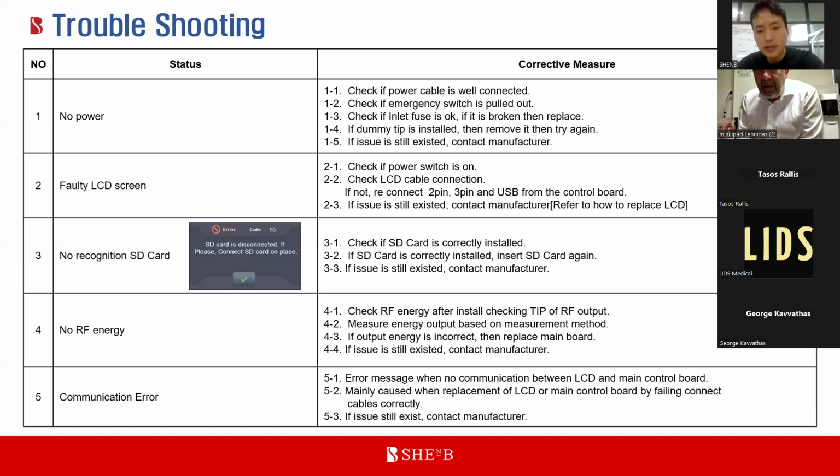Okay. So when we face an RF error, the question that I had is how we can measure the RF energy, how we can be sure that the system emits the RF energy correctly. This is the question that we have.